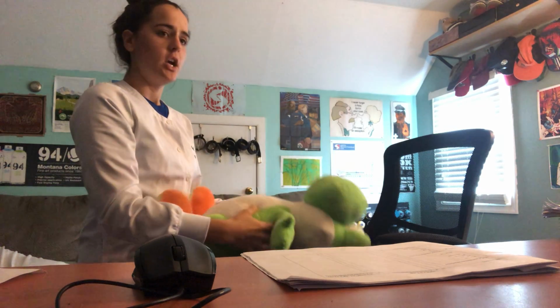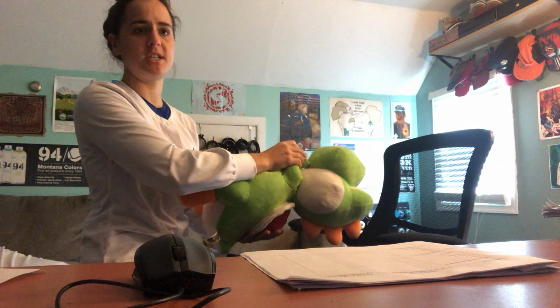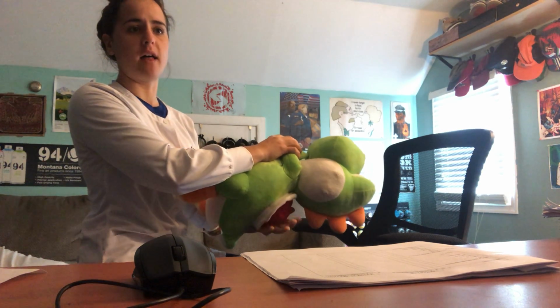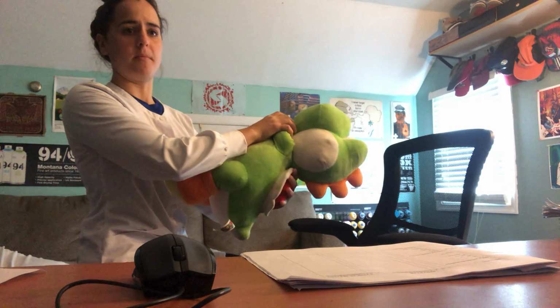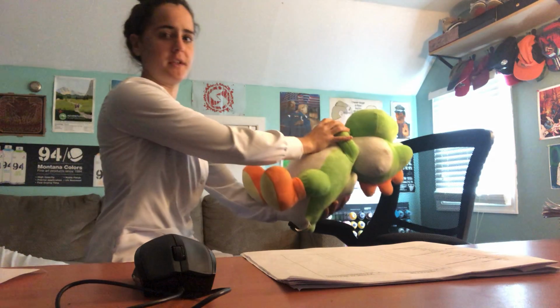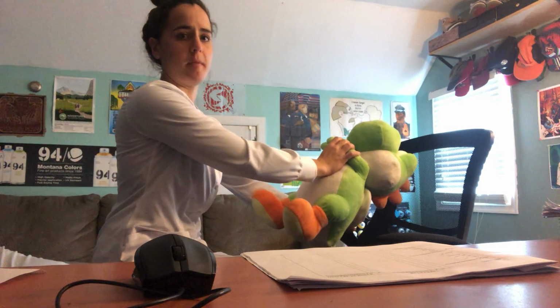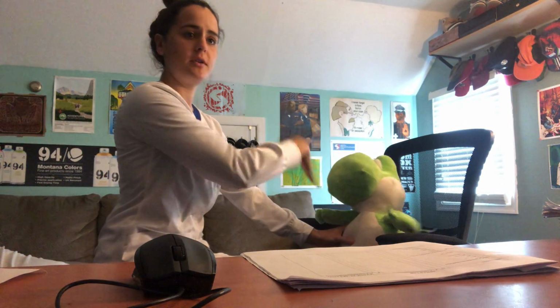on the frame. And now before you move the patient, you are going to want them to have their arms crossed like this. And then you're going to engage the pump to raise the patient about 6 inches from the bed, and then you will unlock the wheels and wheel the patient back, and position your patient over the chair. Then you're going to lower the patient and help guide the patient down to the chair. And then at that point you can disconnect the hooks.